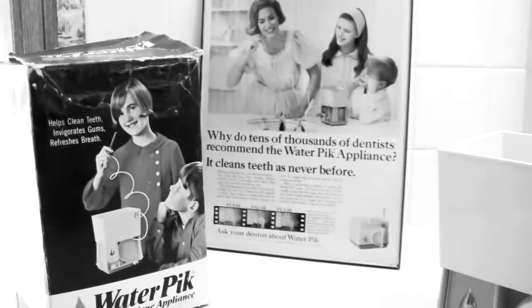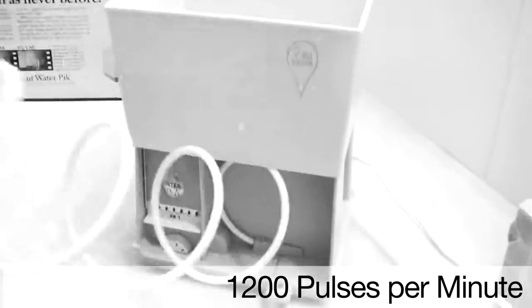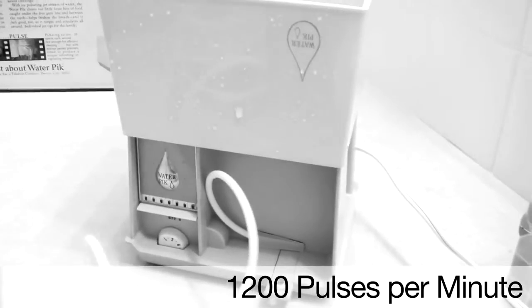I first discovered the Waterpik back in the late 1960s and have used one ever since. It's refreshing, invigorating, and easy to use. Since the 1960s, delivering 1,200 pulses of water every minute and 99.9% of biofilm removal.